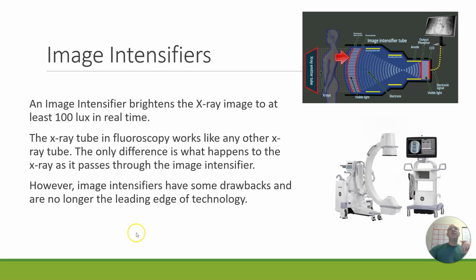A lot of your C-arms will probably have an image intensifier. It's got a dome structure. I know that Beverly Fluoroscopy still uses an image intensifier. The Addison Gilbert Fluoroscopy room has an image intensifier. Salem, you have one image intensifier, but the other one is no longer an image intensifier. And Southern New Hampshire, you don't have any. You guys are all cutting edge. So regardless of where you're going to clinical, you still need to know how these things work for the registry.